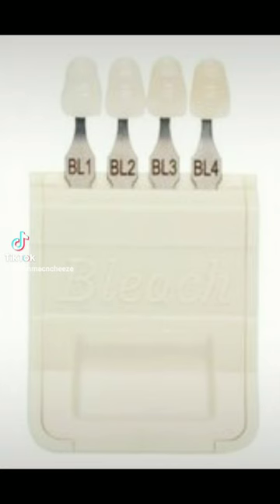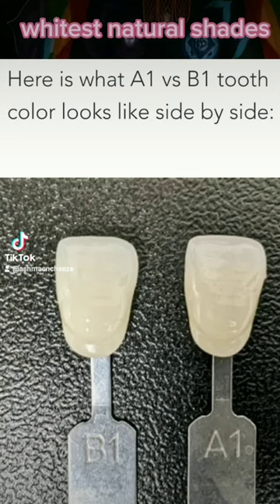These shades are pretty much universal. Historically, B1 and A1 were the two brightest shades. This was before people in Hollywood started bleaching their teeth and everyone wanted whiter teeth. So here comes your bleach shades or BL shades. So B1 followed by A1 are the whitest naturally occurring shades, meaning somebody on the street with regular teeth won't have teeth whiter than a B1. But having really white teeth doesn't necessarily mean they're fake, because nowadays you can just say that you got your real teeth bleached. So it's really up to you what kind of teeth that you want, what color.